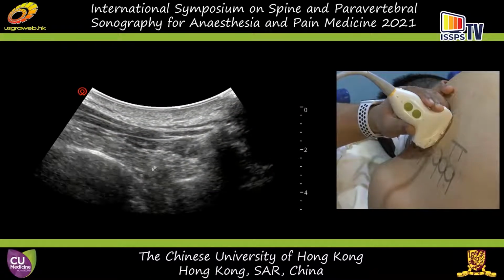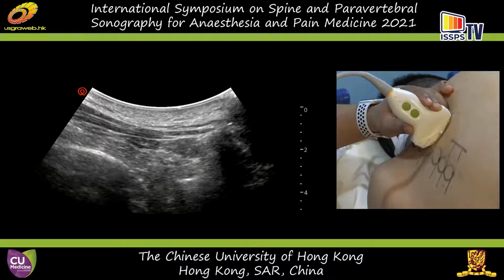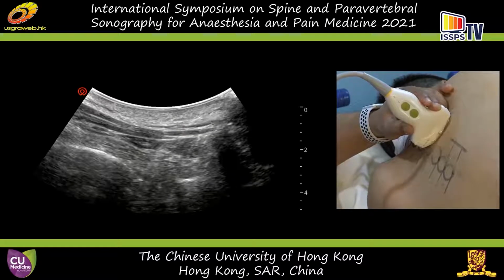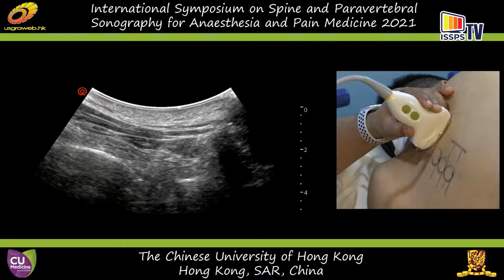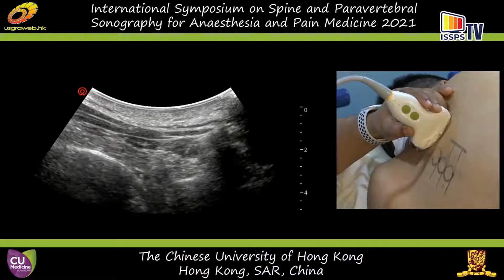So in this case, if you freeze the image and then use the measurement tool, and then just show how to do the measurement distance. Just press distance. No, use tool, use distance. No, I want you to use the, yeah, and then show the needle. Oh, you do it, Ranjit.